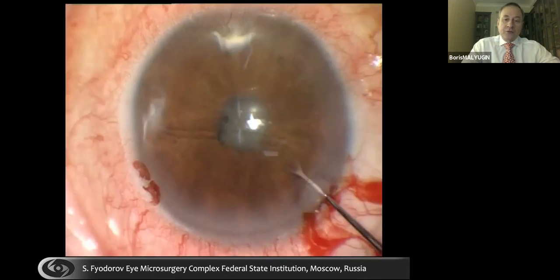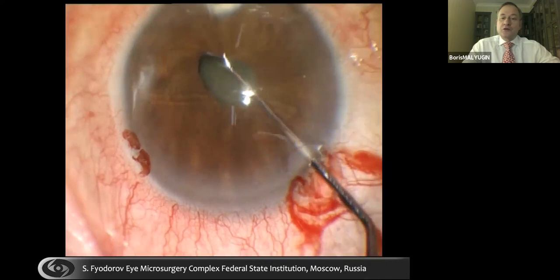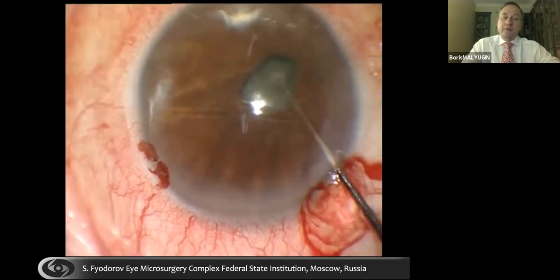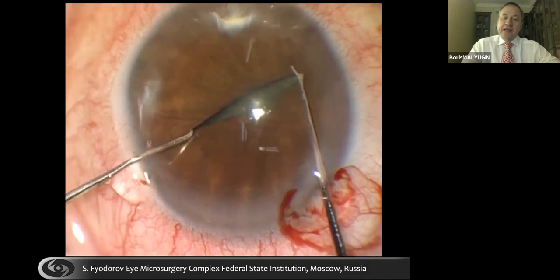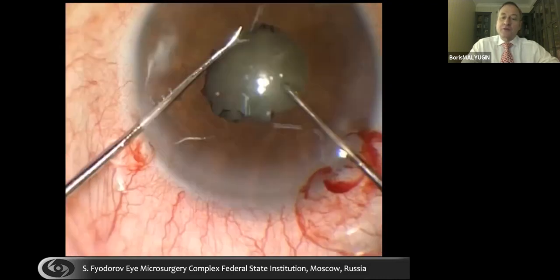The other option is to utilize peripupillary membranectomy, and this is the pupil stretching technique when we use two instruments, stretching the pupil on opposite sides.